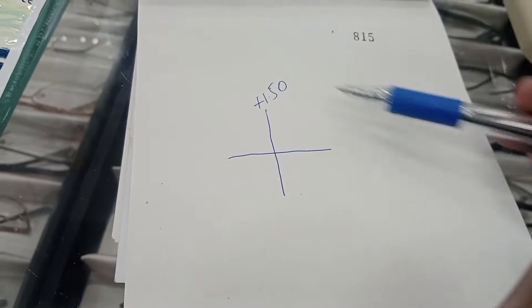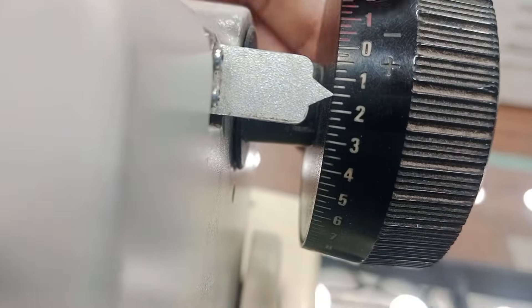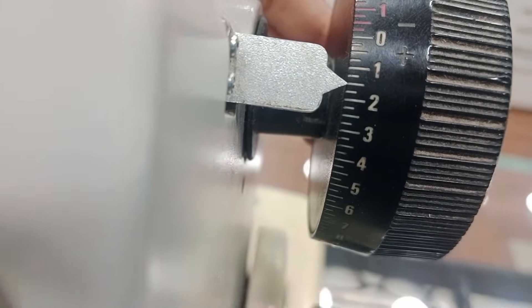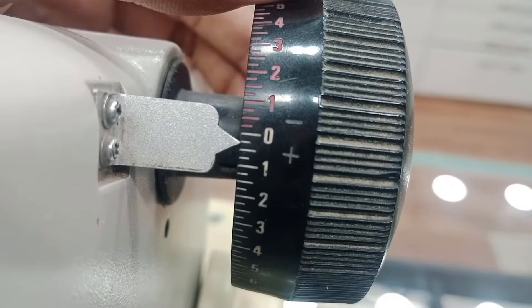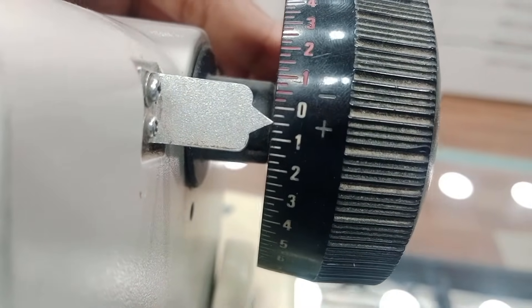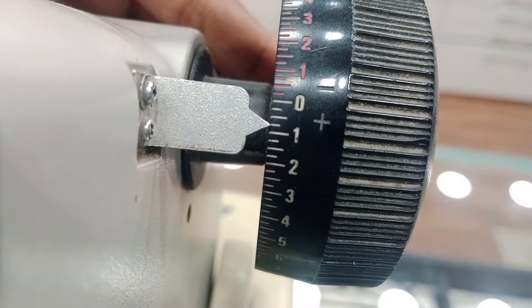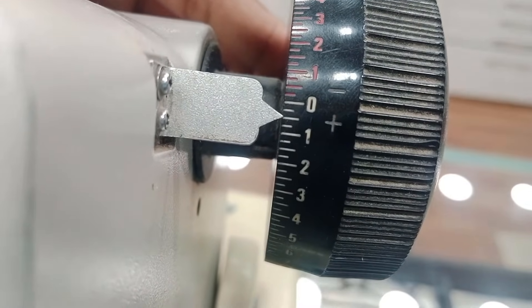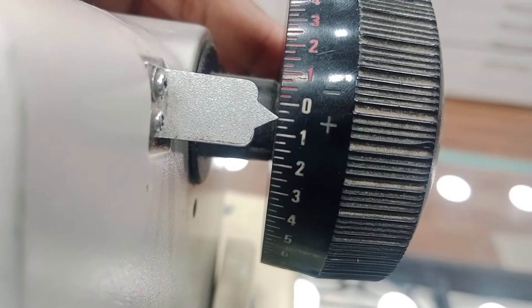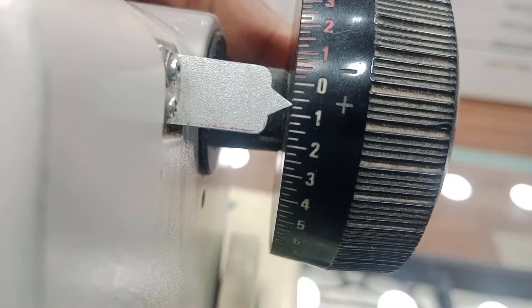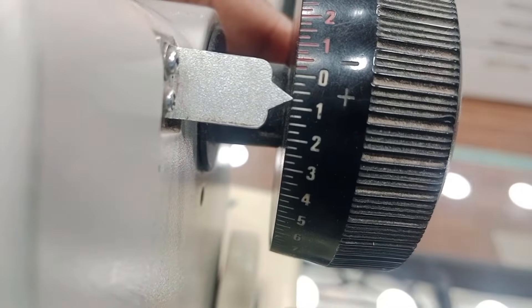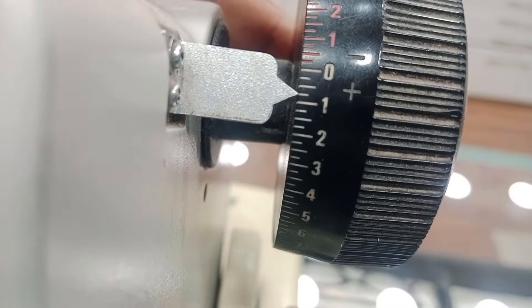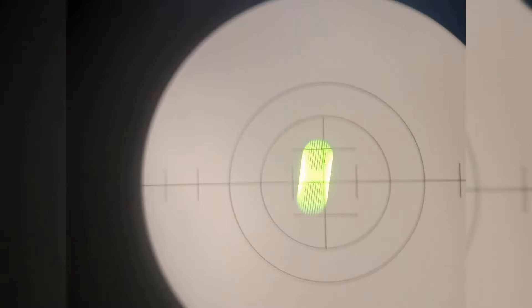Now we will clear another meridian. Because we have two meridians, the lens is cylinder or sphero-cylinder. So let's rotate the dial to clear the other meridian, and it's clear at plus 0.75 more or less. Yes, it's clear at plus 0.75.